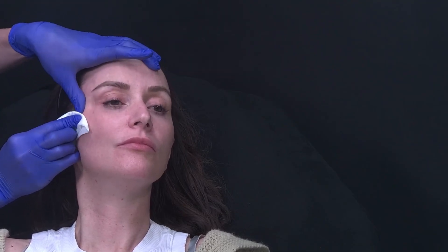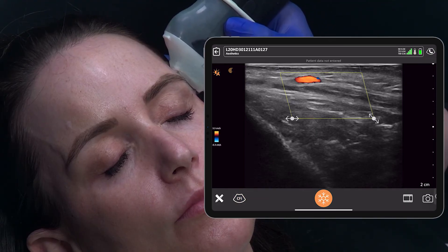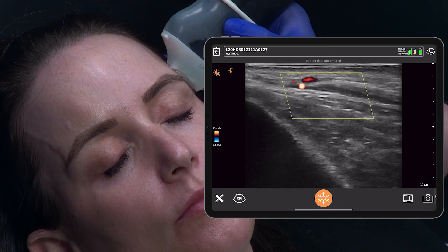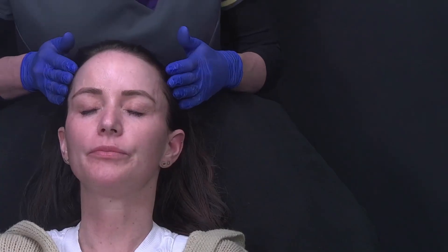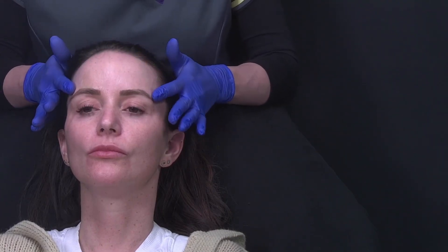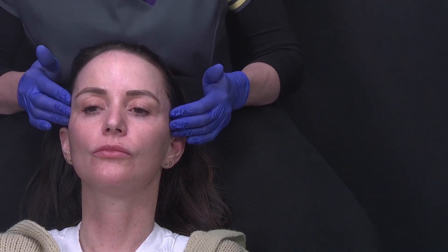I can then use gentle massage of the injected area to smooth the product in the tissue plane and make sure it spreads evenly. Checking after placement, I see my filler in the interfascial plane. Going on to Doppler mode, I can see the superficial temporal artery in the layer above it, which is what I expect. Here's my filler, which is anechoic, or black. Now I have treated both sides — you can see the forehead contour flows very nicely to the temple before blending elegantly with the cheek. With ultrasound, I can reassure my patient not only that I haven't damaged their vessels, but also that their filler is where I said I'd put it. I've got an excellent result using ultrasound guidance and we can both go home and sleep soundly tonight.